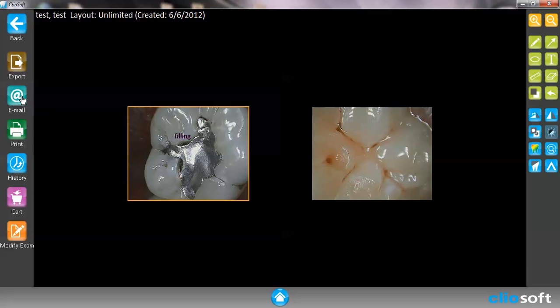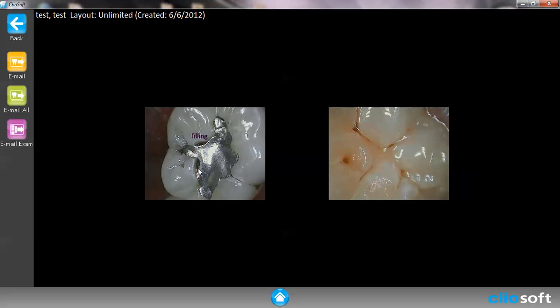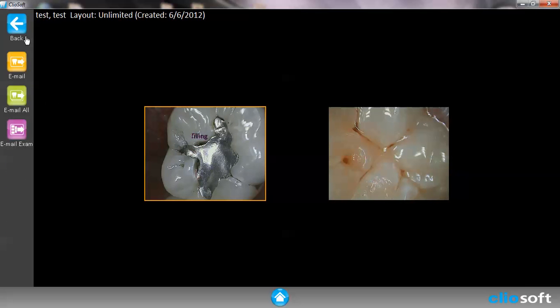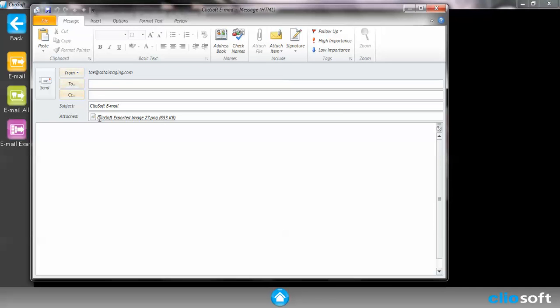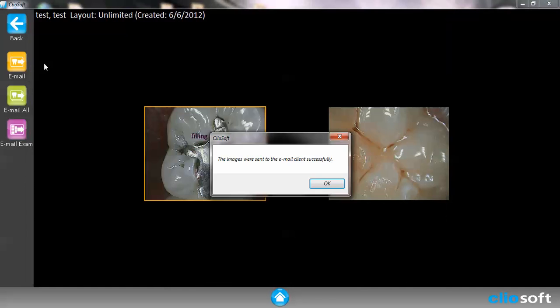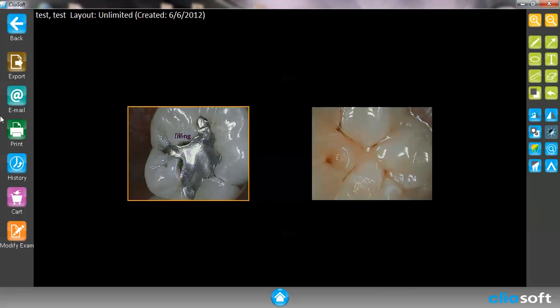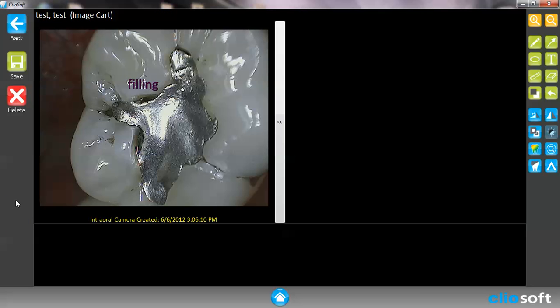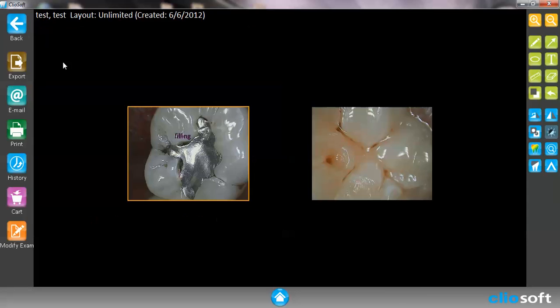We have email, which is automatically attached to your email that's already assigned to the computer. So if I hit Email it's going to automatically attach it to my email. I can print it using a connected printer, or I can save this onto a cart. The cart feature is actually something pretty cool and I'll go over that in a future video as well.